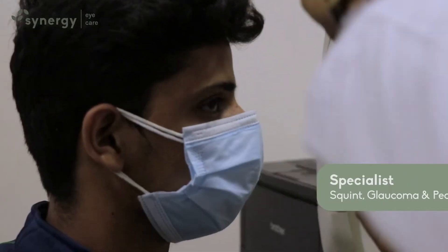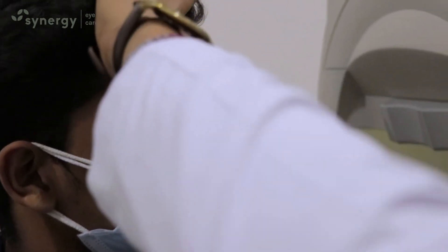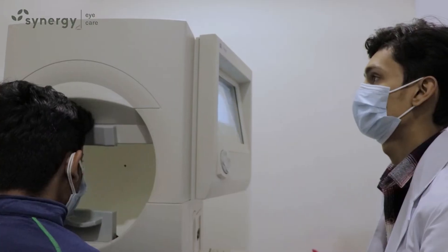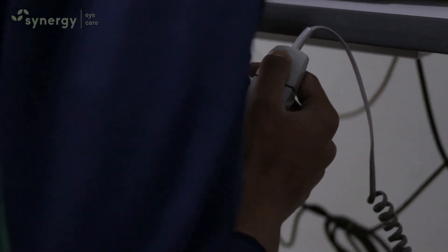At times your eye doctor is going to order a perimetry test for you, which is an analysis of your visual fields. To do the test, you're made to sit in front of a bowl-shaped instrument and look at a central yellow light. White lights are made to flash on the sides of the bowl, and you need to press a button each time you see the flash. A computer records the spot of each flash.